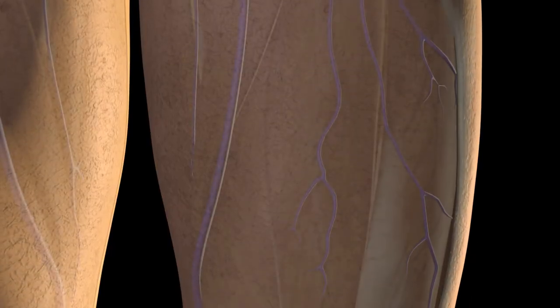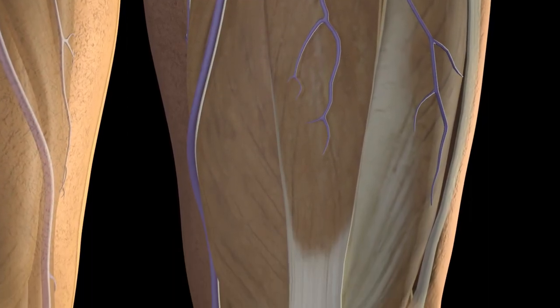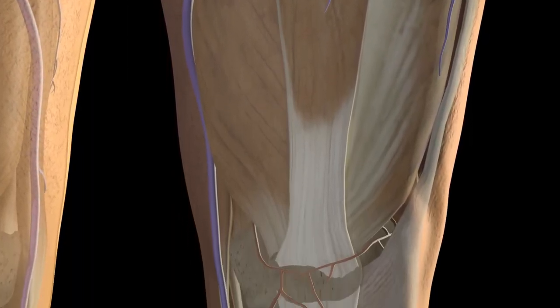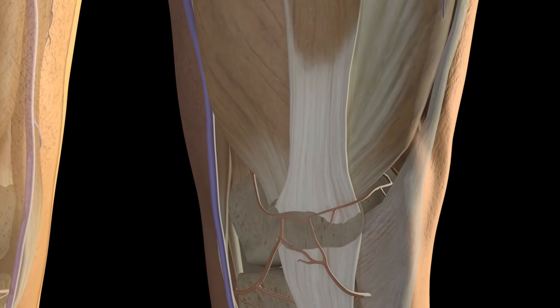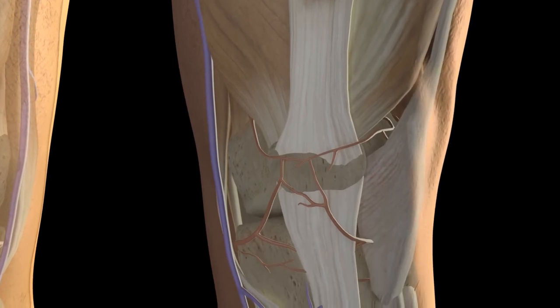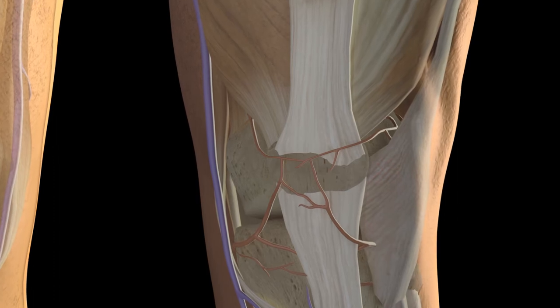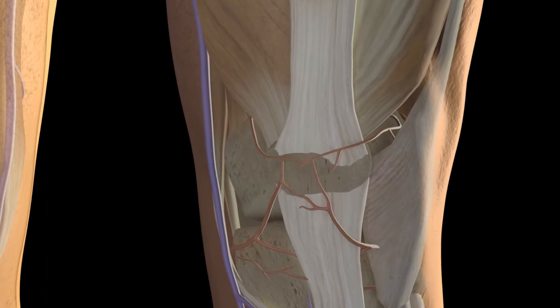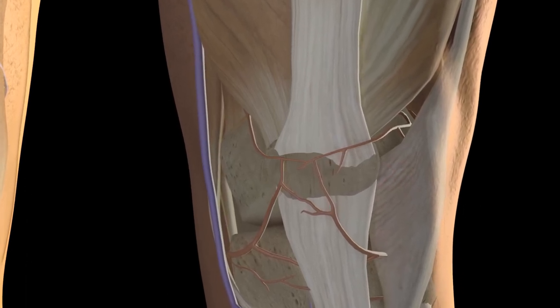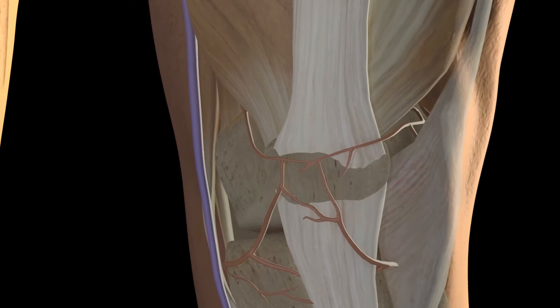The four tendons of the quadriceps muscles join to form the quadriceps tendon. At its inferior end, it is attached to the patellar ligament. The suprapatellar bursa is a potential space between the quadriceps muscle and femur that reduces friction between the two surfaces.